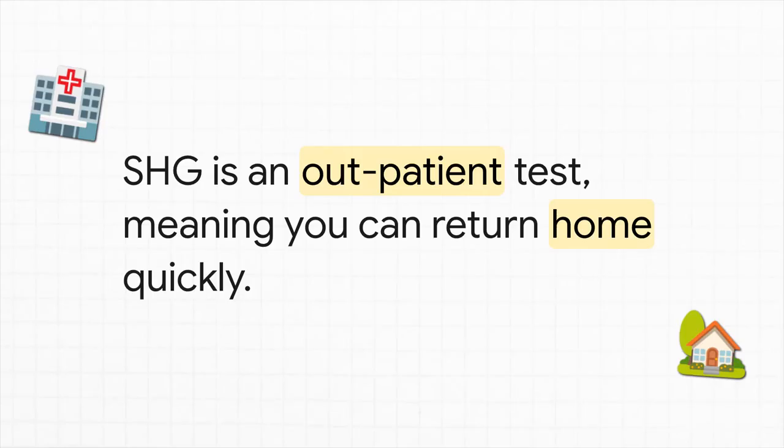This is an outpatient test, meaning there are no overnight hospital stays, there's no heavy general anesthesia to recover from for days. It's entirely designed around getting you the scan you need and then getting you straight back to the comfort of your own home so you can relax for the rest of the day.